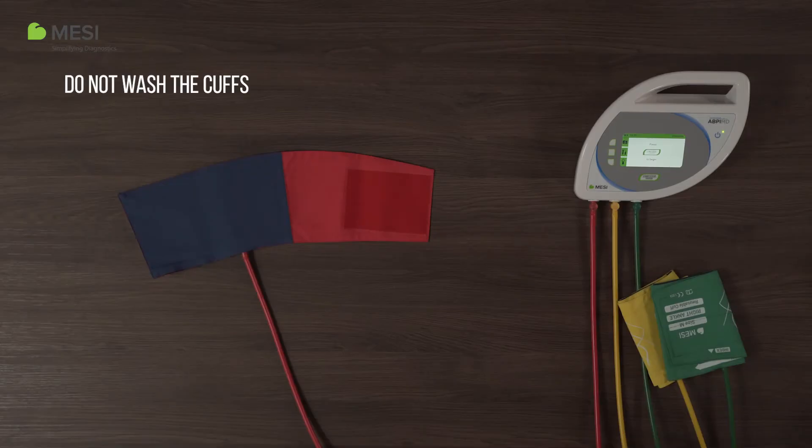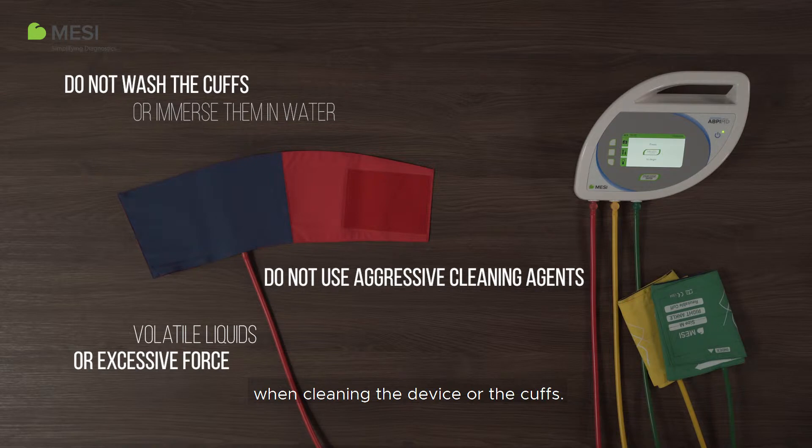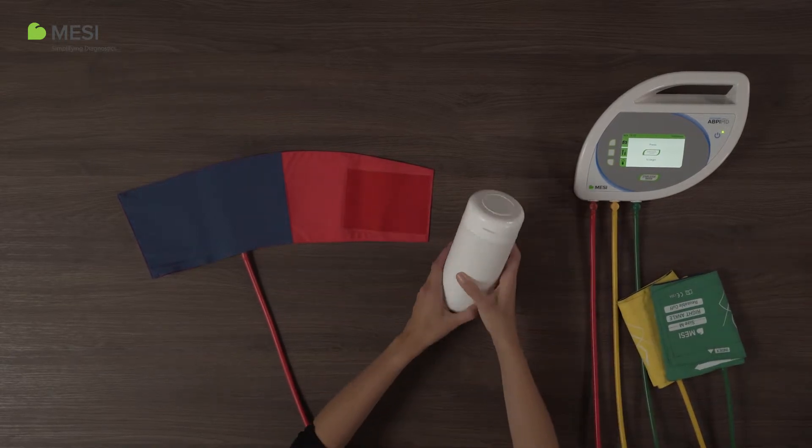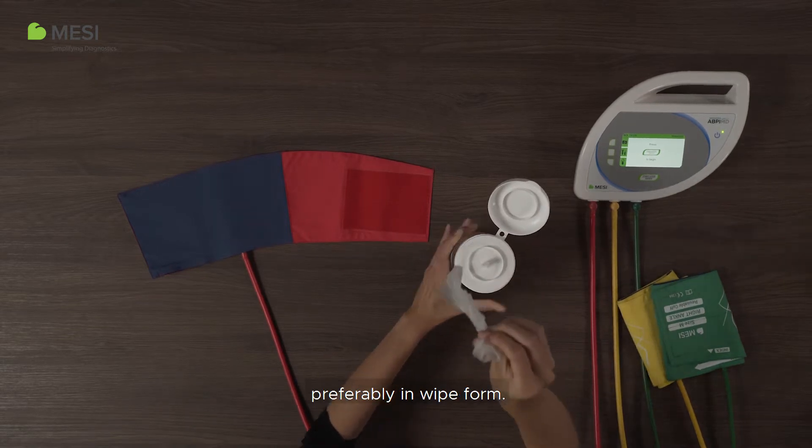Do not wash the cuffs or immerse them in water. Do not use aggressive cleaning agents, volatile liquids or excessive force when cleaning the device or the cuffs. Instead, use a quick drying disinfectant, preferably in wipe form.